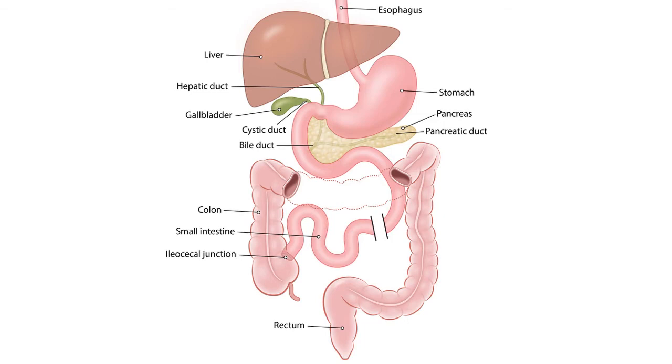So, when you do a gastroscopy, what you do is you insert the gastroscope through the mouth, down the pharynx, enter the esophagus, go down the stomach, duodenum, all the way to the beginning of the jejunum, that is the DJ flexure. So, you can see a lot of stuff in the esophagus, stomach and duodenum. You can make a diagnosis and you can also treat problems there.